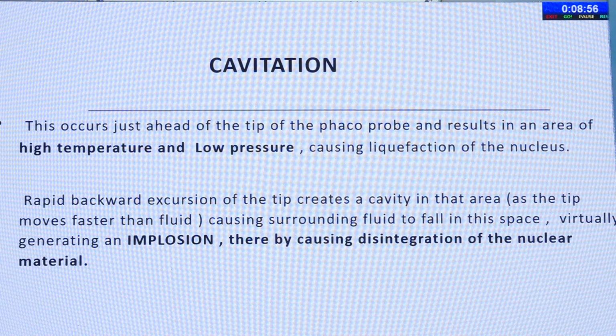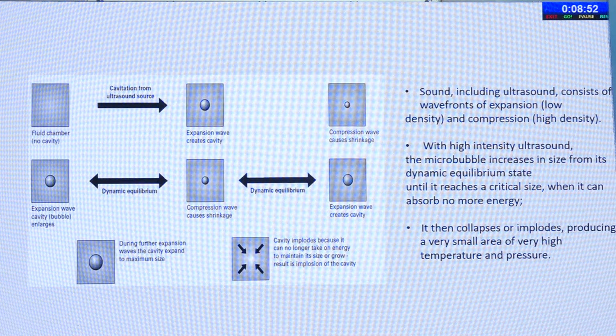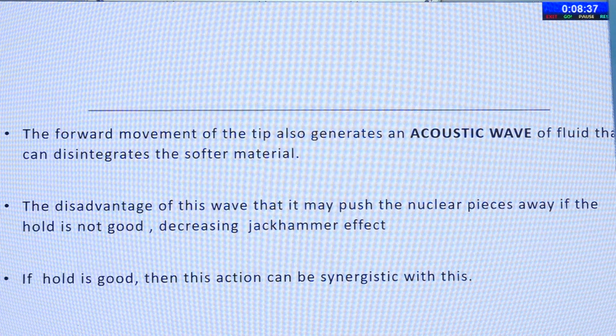And cavitation, like I explained, is that the fluid falls into the space that is created. It is better explained with this diagram, that whenever you are pressing the foot pedal, you are giving a certain amount of ultrasound power. So this gives wave fronts of expansion and compression that create an area of high temperature and low pressure, and the whole system collapses within that cavity.